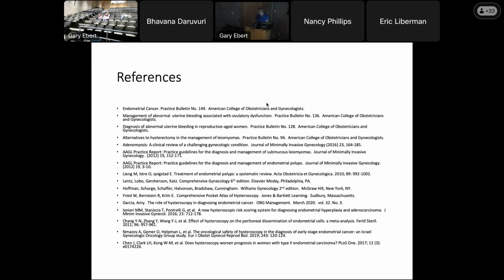And postmenopausal patients, regardless of the size of the polyp? I remove them, yeah. I recommend removing those, especially if they're symptomatic. If they're having postmenopausal bleeding and they have a polyp, yes, it should come out. The asymptomatic ones are the more difficult ones because you're doing an ultrasound for some other reason. And if you do find a 4 millimeter polyp in somebody who has no bleeding, and if they have risk factors, I would remove it. I would counsel the patient and recommend removing it.